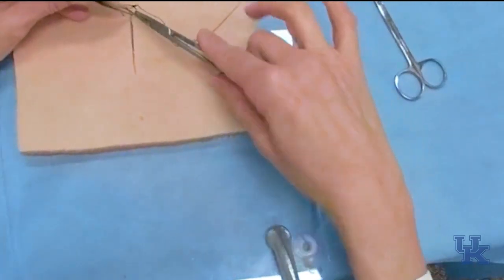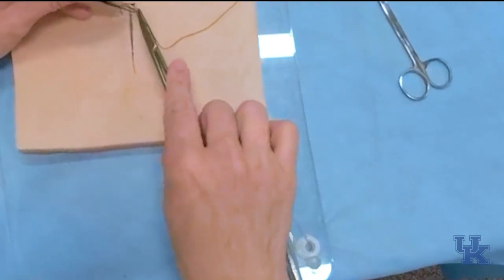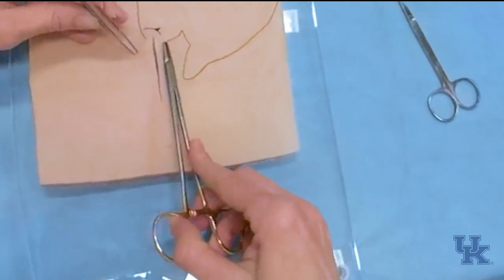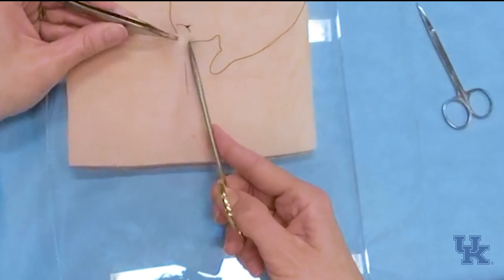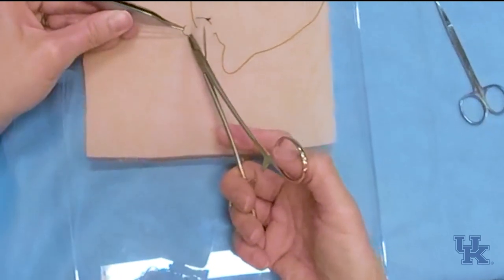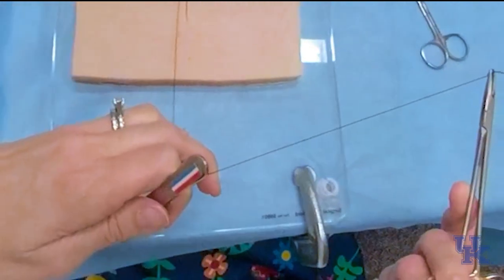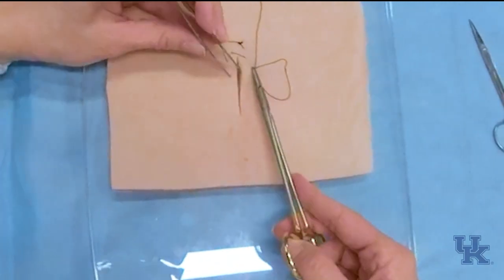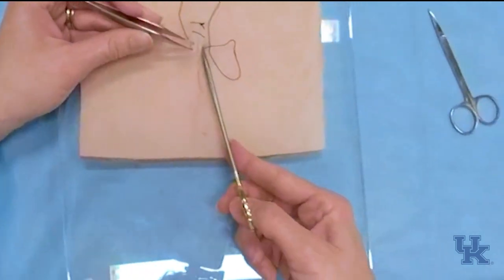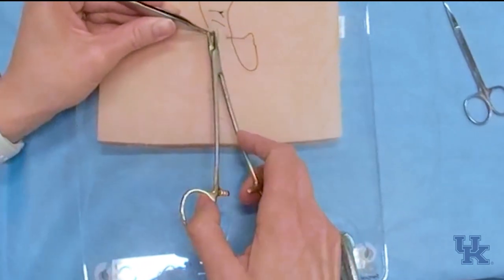And if you see my hand here, I've grabbed the instrument differently to put that stitch in, and sometimes that can be helpful. Sometimes your fingers in the holes when you're doing that side can be a little bit more difficult. You can do this, but you see my wrist and everything is rotated.